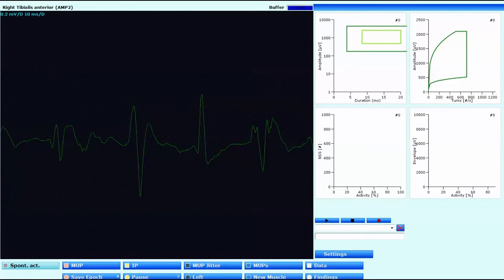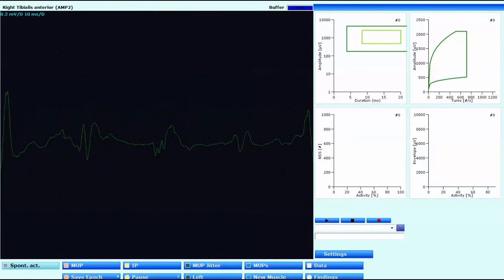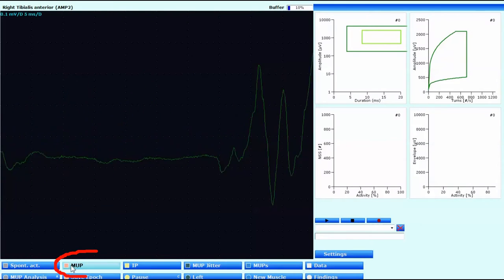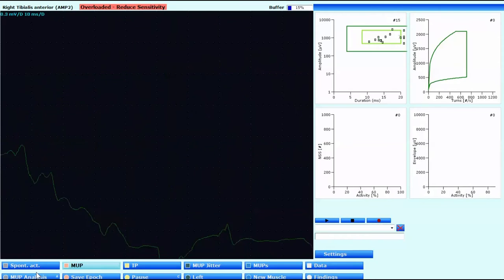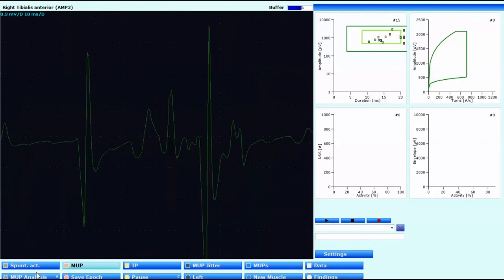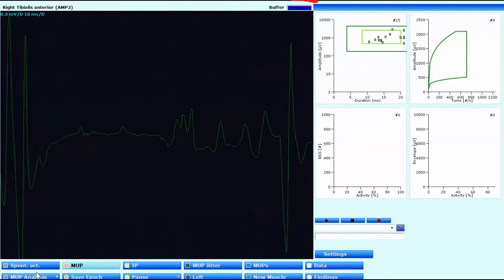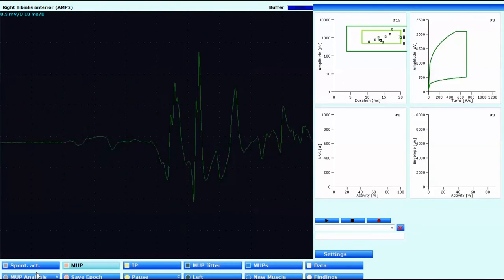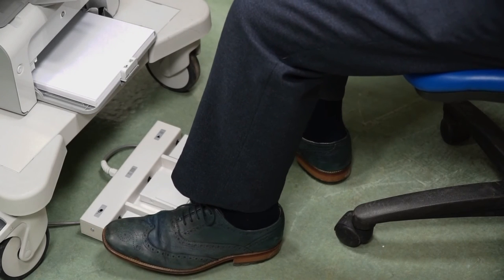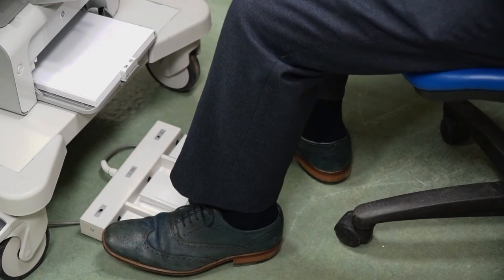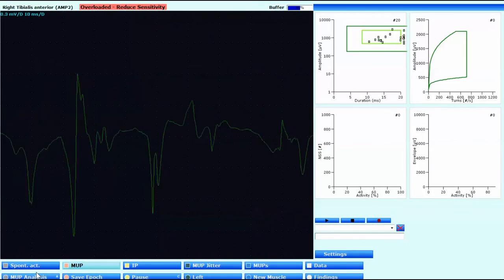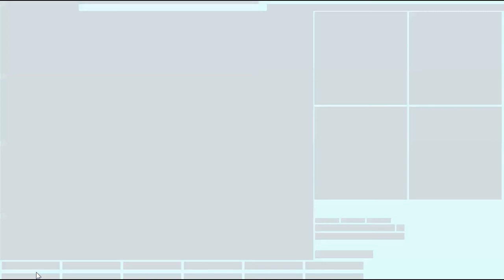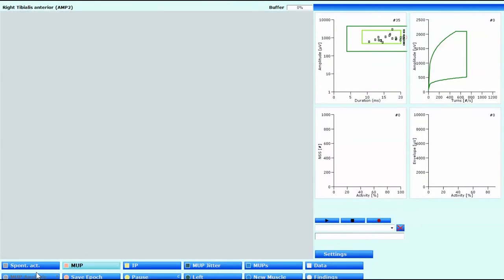We start off with the Spontaneous Activity window and we can see the motor units here. We then activate the MUP analysis program by clicking on MUP, and the data is acquired. You can see the buffer mark expanding on the top right-hand corner as data is acquired. Then all we have to do is click on MUP analysis on the bottom left — you can either do this via the foot paddle with the left switch, or directly on the control box. We can just carry on adding data as the buffer fills.